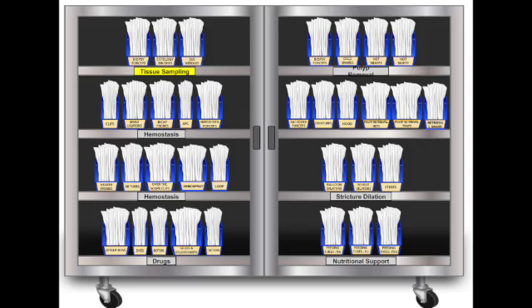Because it's non-contact and covers broad areas, it's the go-to for ablating tissue. That means destroying unwanted tissue layers, think residual polyp tissue after removal, treating Barrett's esophagus, even debulking parts of a tumor to relieve obstruction. Wow, okay. Ablation. And it's also really useful for dealing with stents.